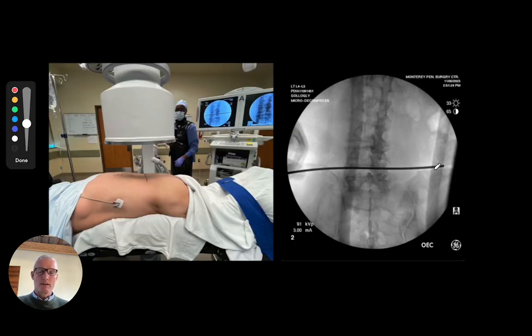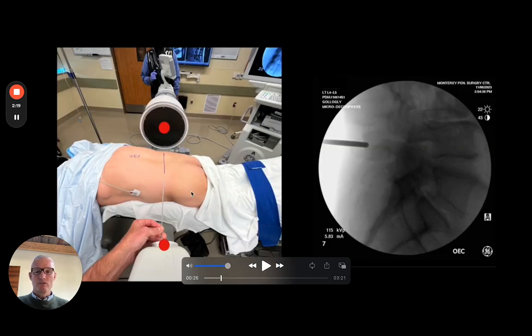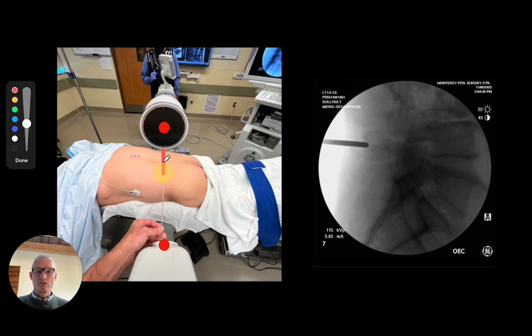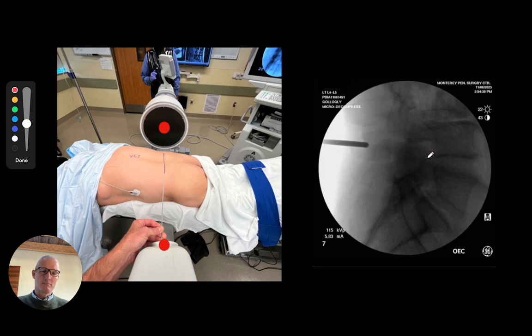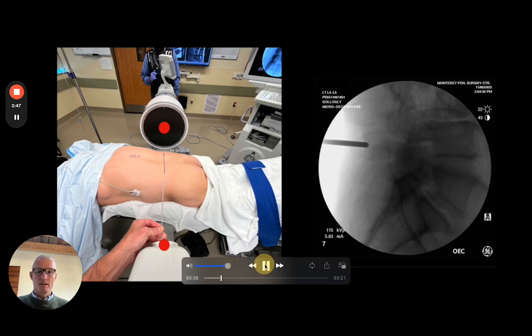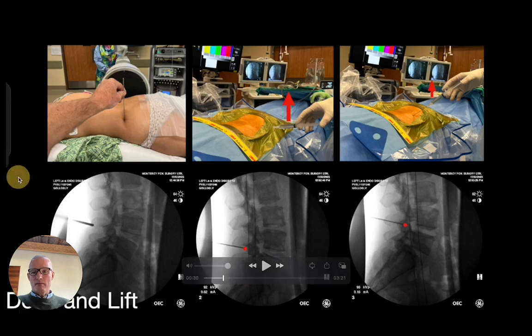I begin by taking a single orthogonal AP x-ray of the spine and establish the center line of the disc. I then swing the x-ray into the lateral position and use the line drawn on the skin to establish the center line of the beam of the fluoroscopy and then take a lateral x-ray. Here a representative fluoroscopy picture at the 4-5 level is shown. There's one facet; the second facet will be here. The starting point is two facets posterior to the posterior annulus in line with the disc space.